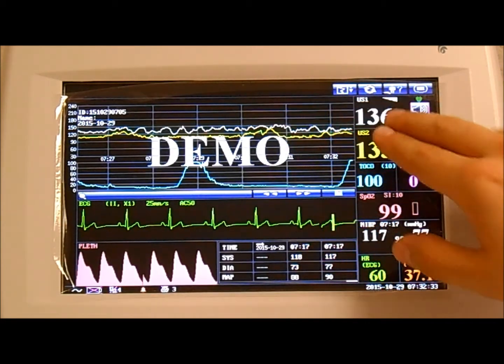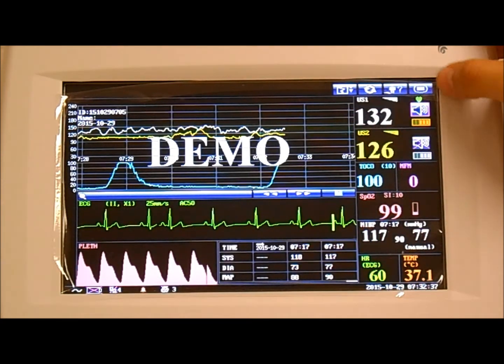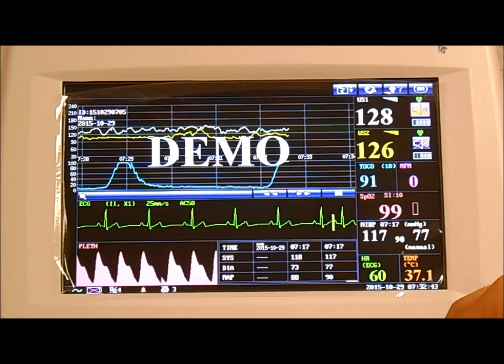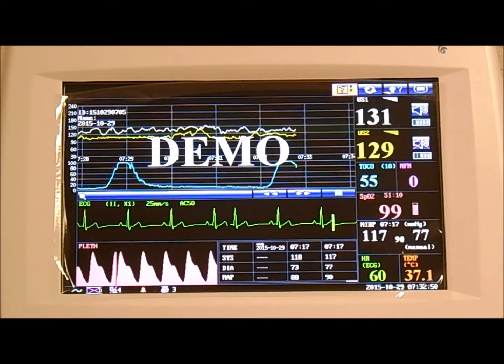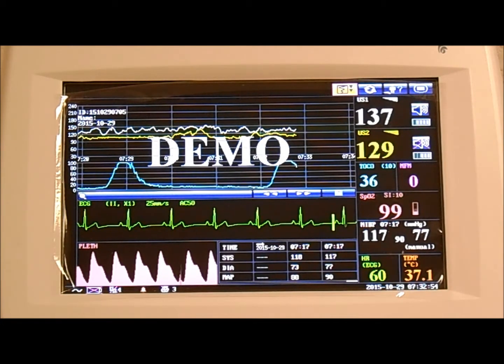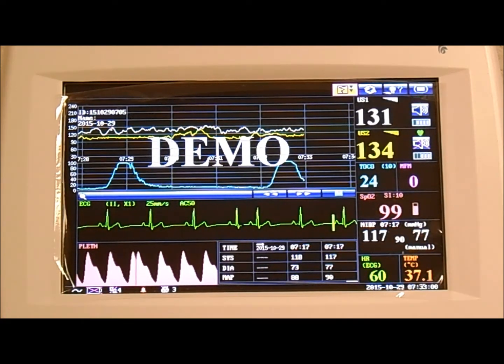And if you take a look in the upper right hand corner of the screen, we have some very useful icons. We take the knob to navigate the screen. The first one here is used to advance paper. So if you want to rip off a piece of paper, and it's right on the middle so you can't get a good breaking point, you can use this icon to advance the paper to be able to easily rip it off.